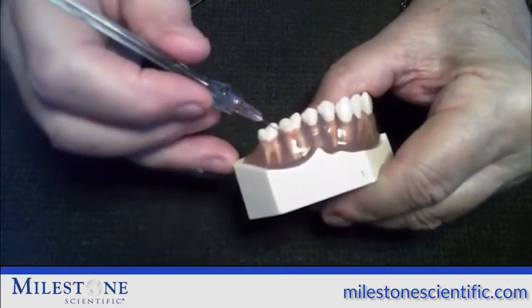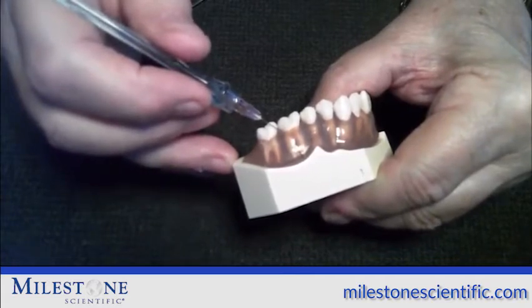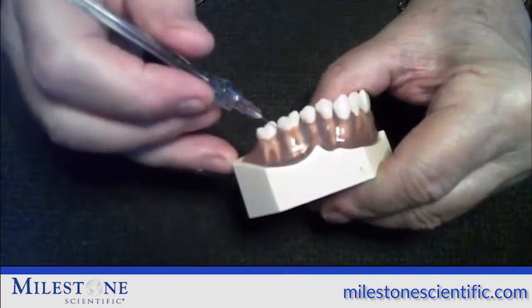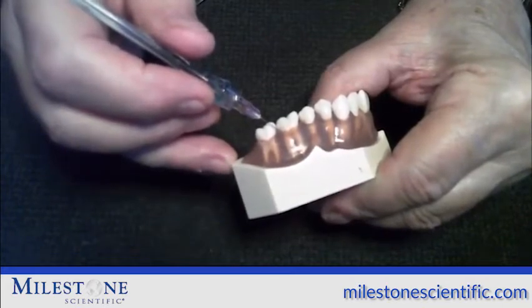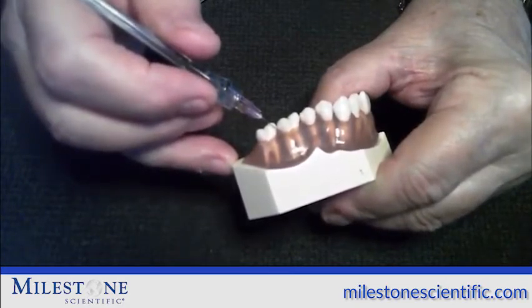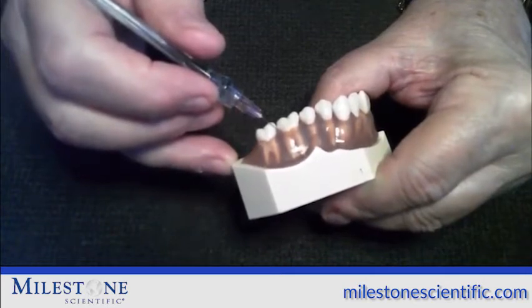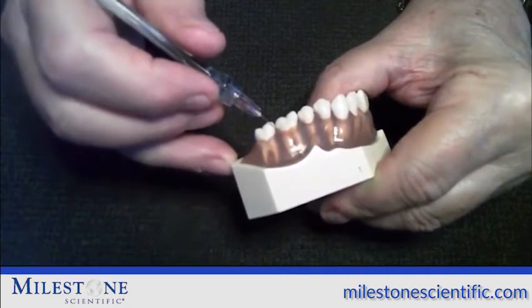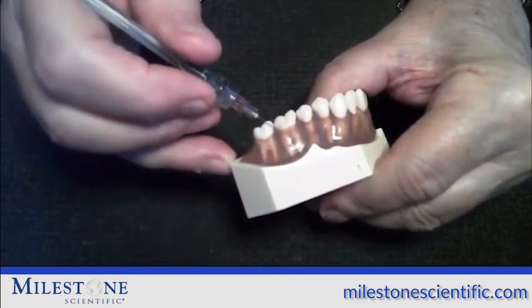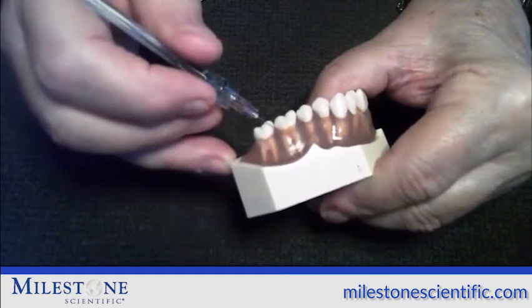When we hear any of the sounds, stop and hold the needle in place. How much anesthetic we deliver depends on the tooth and the drug being used. If using lidocaine, put half a cartridge on the distal. When you're ready to remove the needle from the tissue, hit the foot pedal and go into aspiration — aspiration starts and it's six beeps. In the middle of aspiration, take the needle out of the tissue and see how much anesthetic comes out. The DPS lights and sounds tell you you're in the proper spot, but they will not tell you how much pressure you put on the needle that may block the flow of anesthetic from going into the bone. We can determine that by watching how much anesthetic comes out of the needle at the end of aspiration.